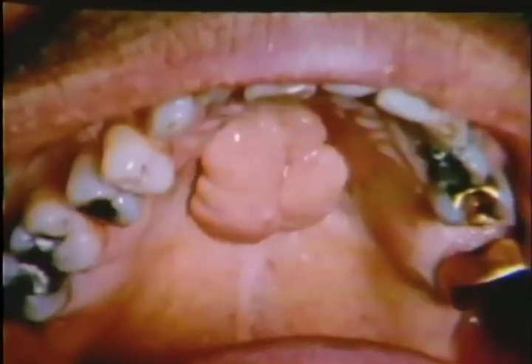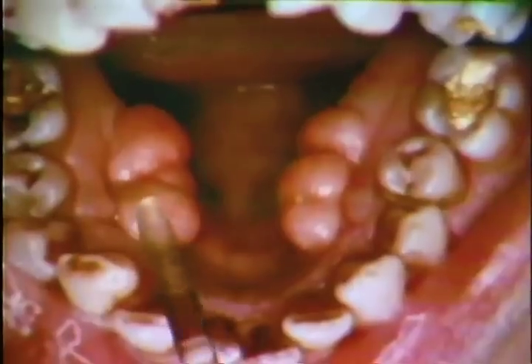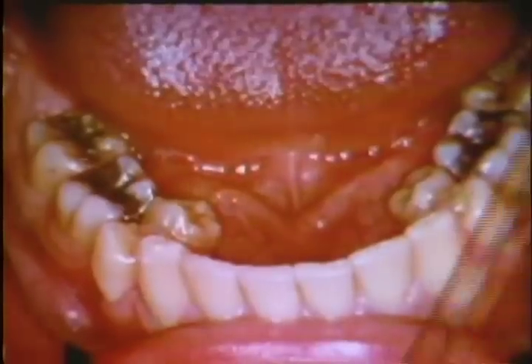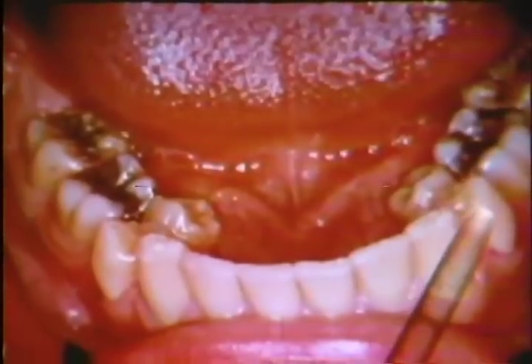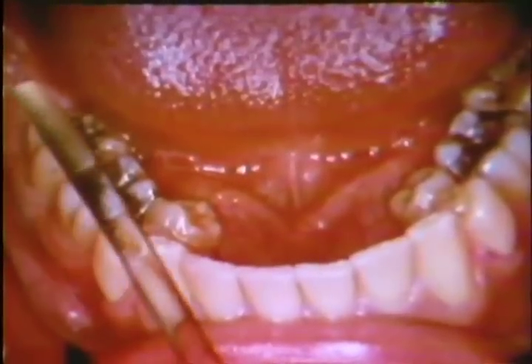Also note that the patient is lacking the maxillary left first molar and both third molars. In the lower jaw of another individual, a third example of an obstacle is noted. This is also a benign bony growth, not uncommon, usually occurring on both sides, and is called a torus mandibularis. The film must be placed on the lingual side of the torus when radiographing the patient's teeth, and care must be taken not to bruise the growth. In yet another case, the lower second bicuspids are displaced lingually, requiring special methods to successfully radiograph the interproximal contact areas.